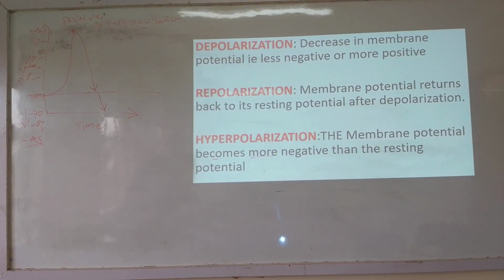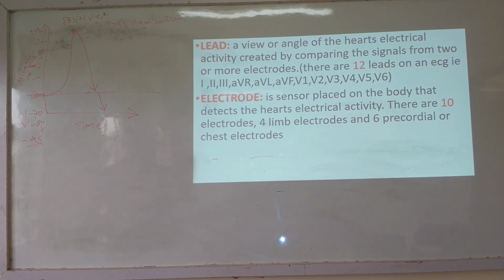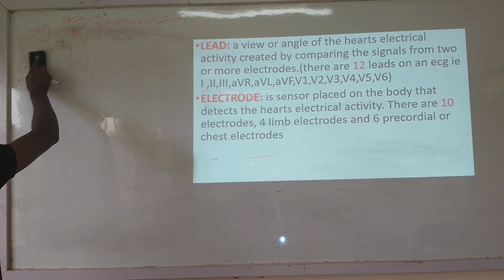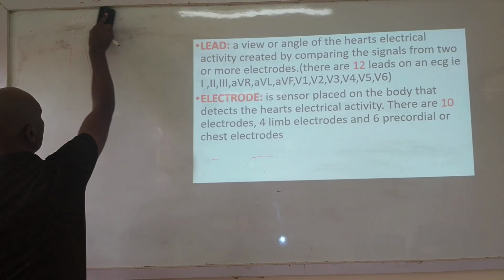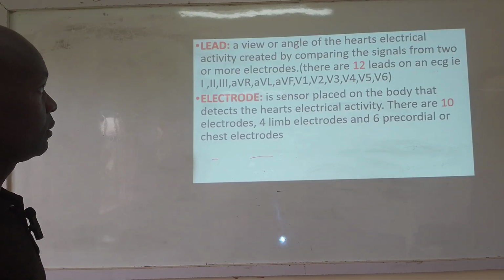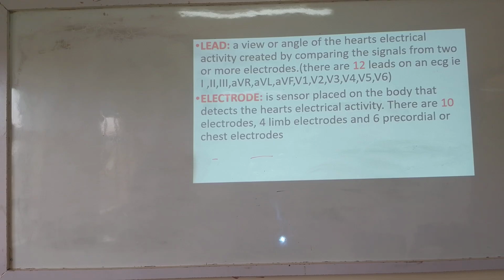There is something called a lead. This is just a view of the heart's electrical activity, which is created by comparing the signals from two or more electrodes.